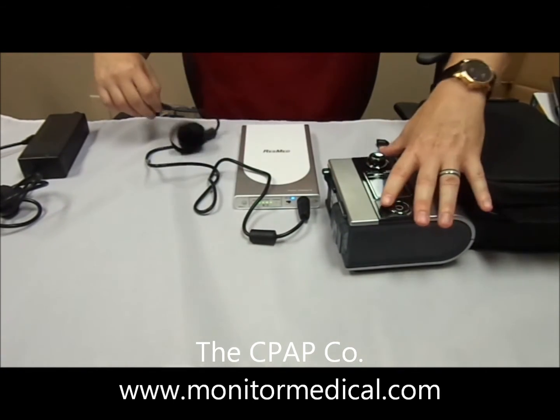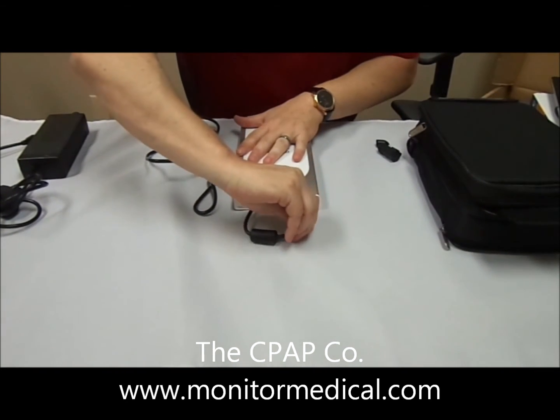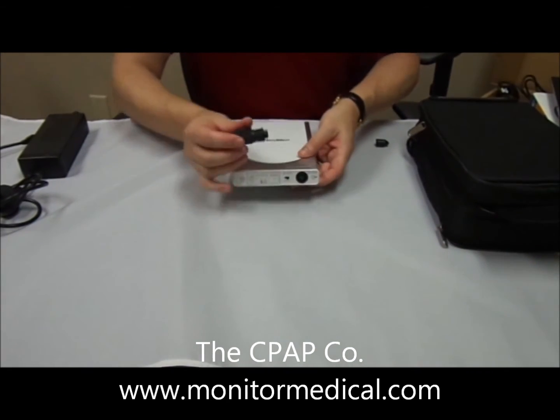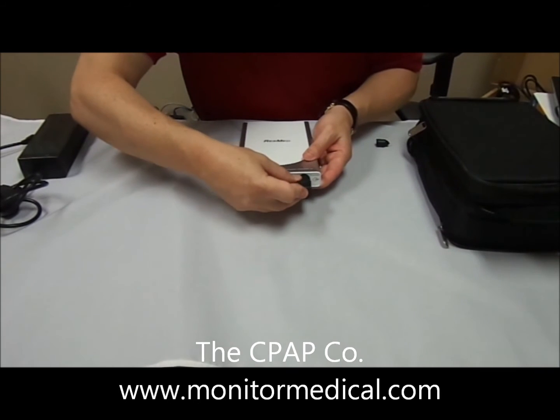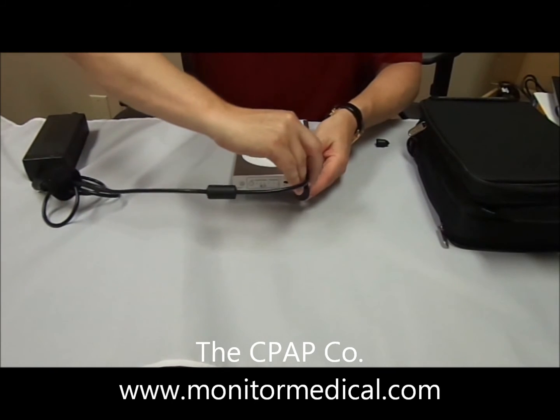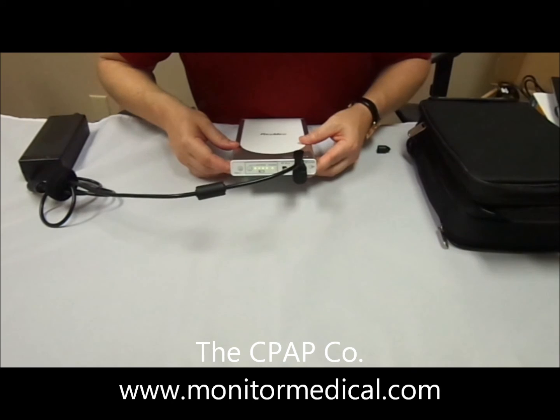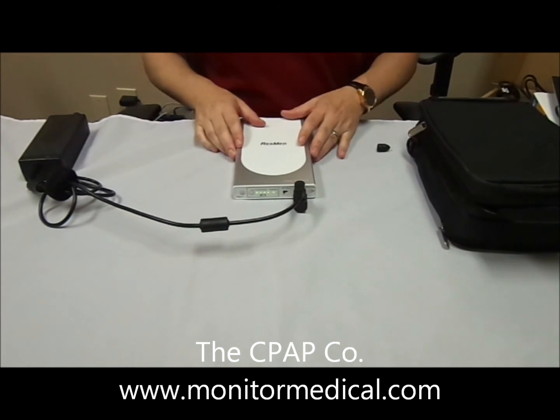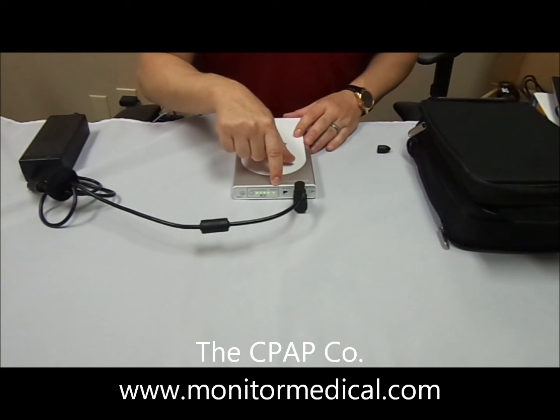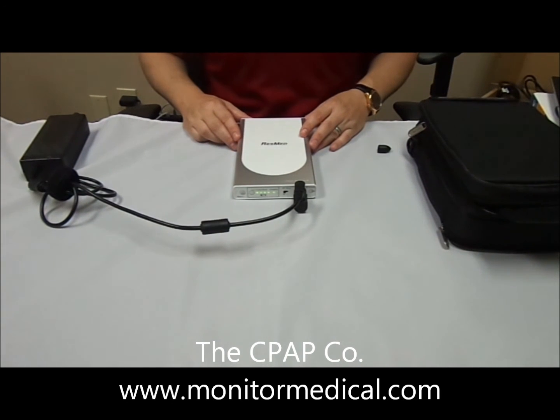Let's talk about how to charge after this has been used. You want to disconnect your S9 and DC cable, then reconnect your PSU adapter for charging and connect it to the S9 power cable. You want to turn it off to charge, and let it go until this light right here is a solid green. Then you'll be 100% charged and you can store your ResMed Power Station 2.